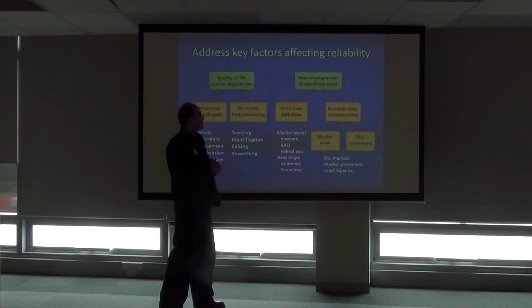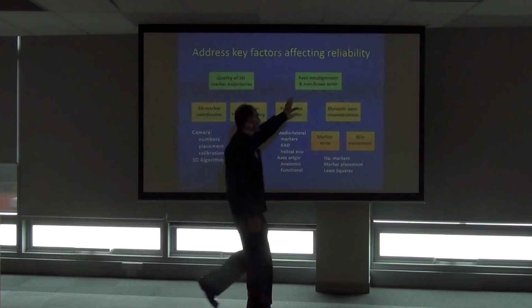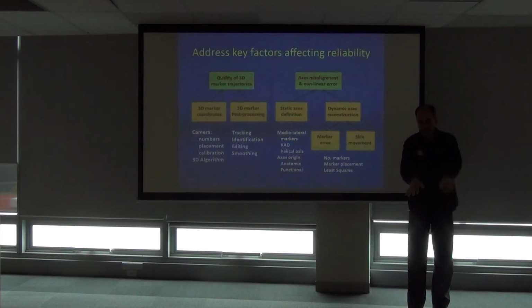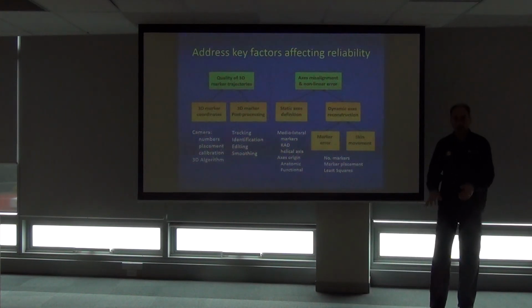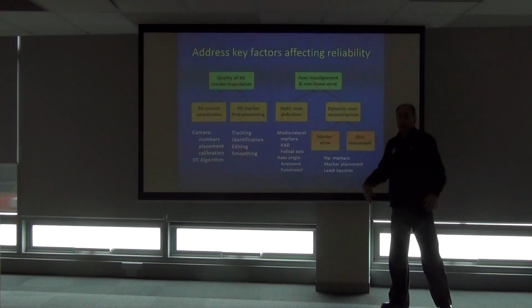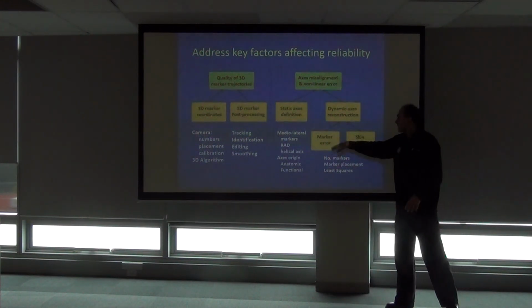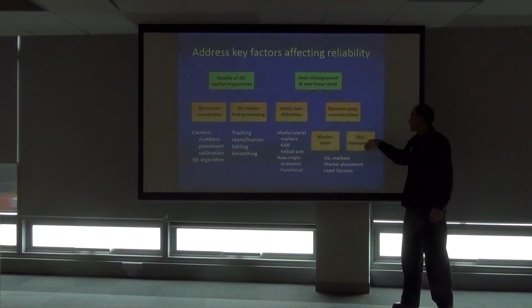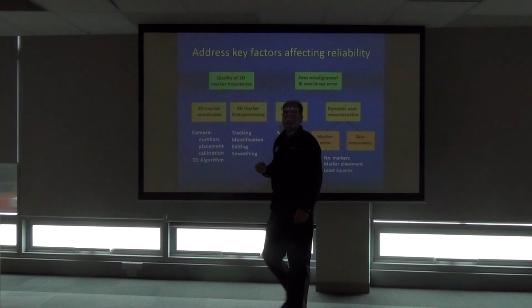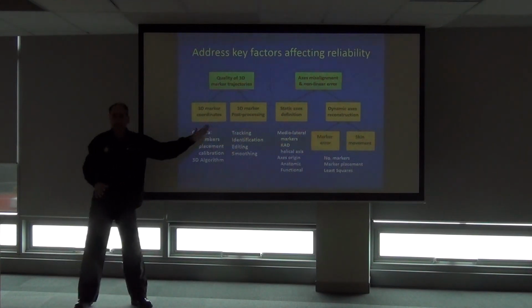The other thing, axis misalignment, we've got the static definition that we've seen, so how you define your axis in a static pose, and then you've got the dynamic, which comes on top and adds to it. So you've got a static offset and a dynamic part, which goes with it as you're walking. Your dynamic one has marker error, just again your reconstruction stuff, getting markers visible in the 3 cameras and being reconstructed correctly, and then you've got skin movement artifacts, which go into the dynamic, which adds to the static to create axis misalignment. So you've got to address these factors if you're going to do it.